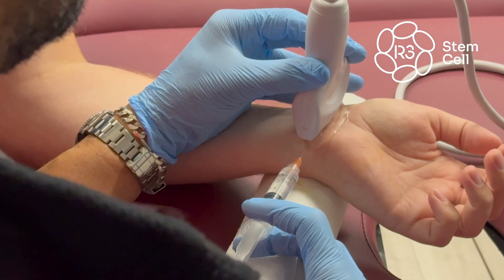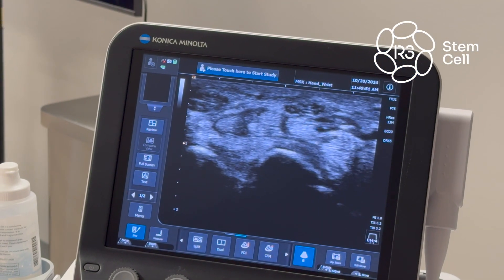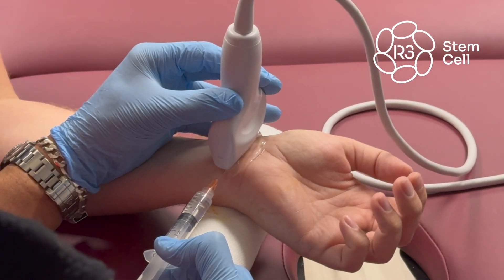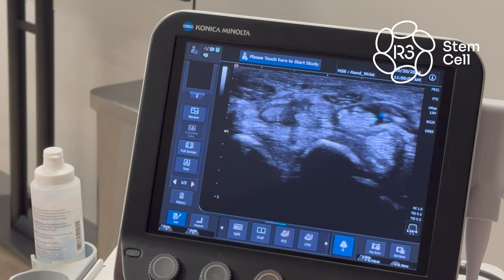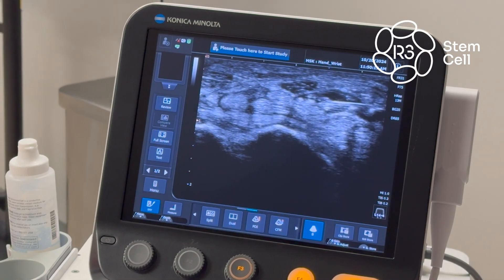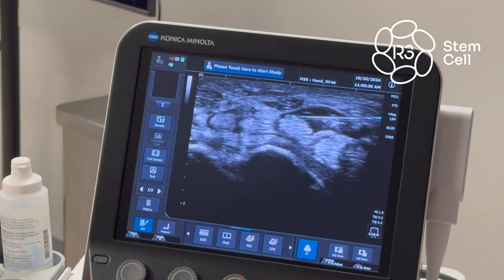Advance on that just a little bit. Stop injecting and advance just a little further. Keep going — right there, go ahead and inject a little more. As you're injecting it's kind of pushing you back a little bit, so I want you to stay in there and separate it out. Keep going — inject a little more. We're going very slow. We've done two cc's here — give me another half cc in there.